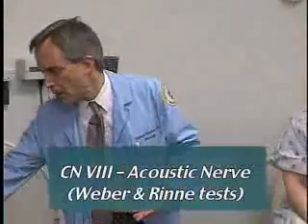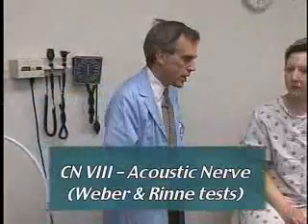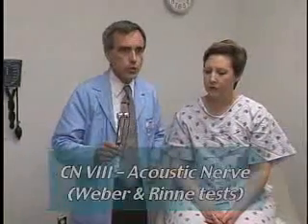If there's a problem with hearing, ringing in the ear, or something of that nature, or an abnormality picked up on screening for hearing, then we could more specifically do the Weber and the Rinne test. We're going to use the tuning fork. These are crude bedside tests — they're not as accurate as audiometry, but they can give us a little more information in the office.